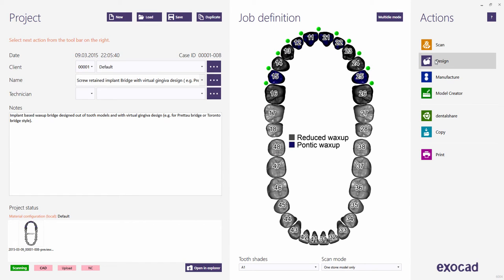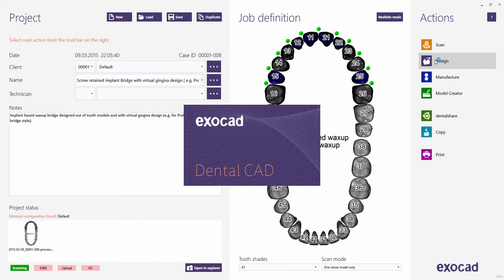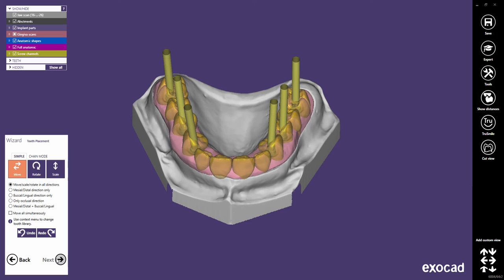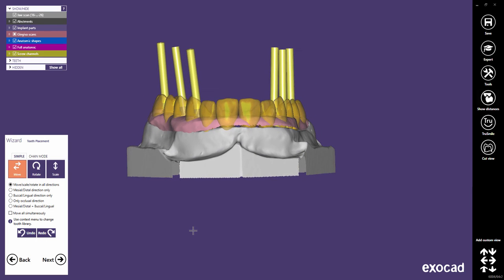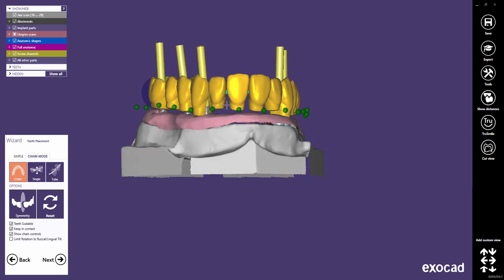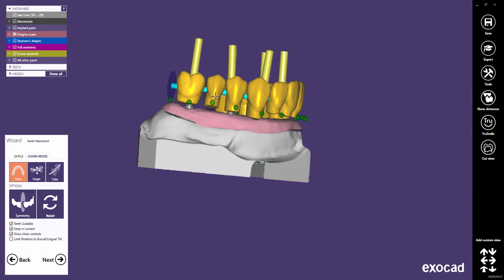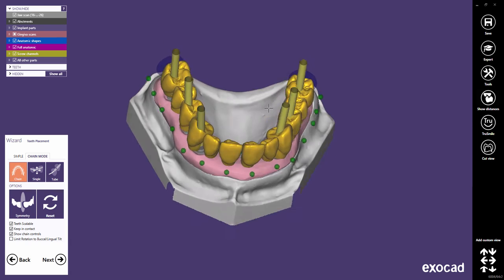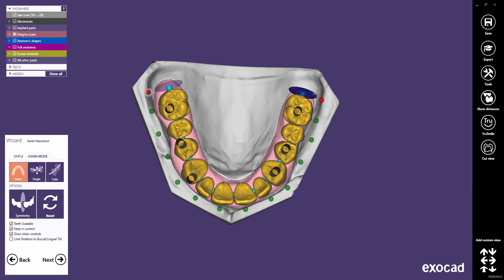Let's proceed to the design. If not required, you can skip the emergence profile step and proceed to the next step, which will be the tooth placement. Make sure that you use the correct tooth library. Only ExoCAD's generic library includes the retention shapes. Why not use the chain mode to do the tooth placement? You will find more information about the chain mode in a separate video tutorial. It is a very nice tool to design full arch setups.